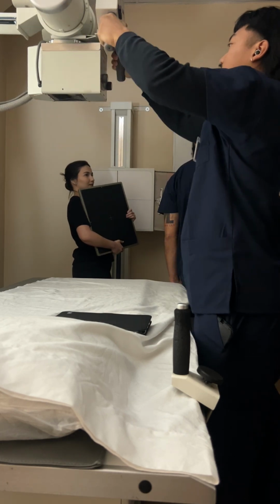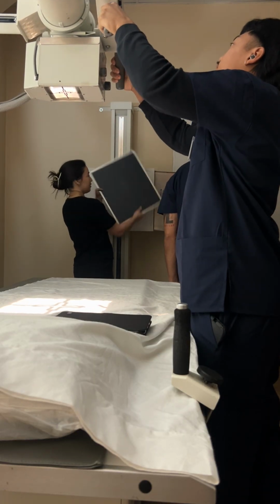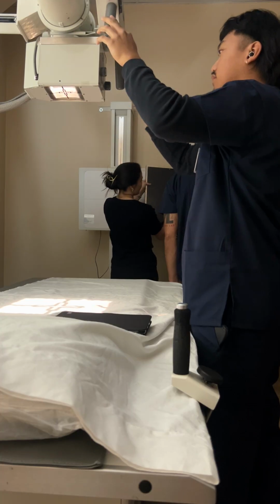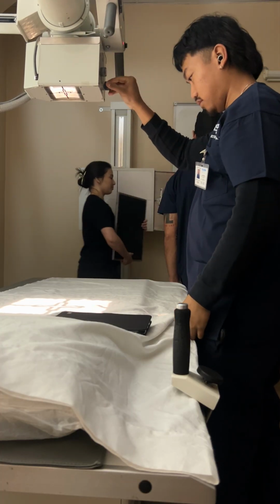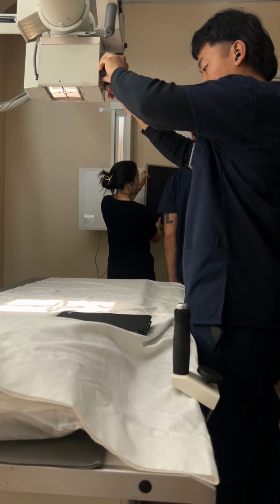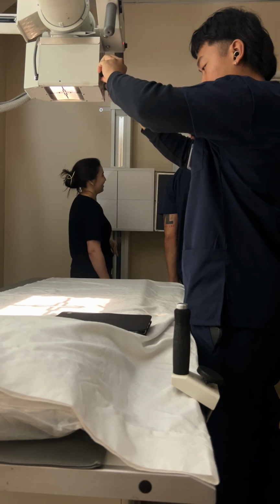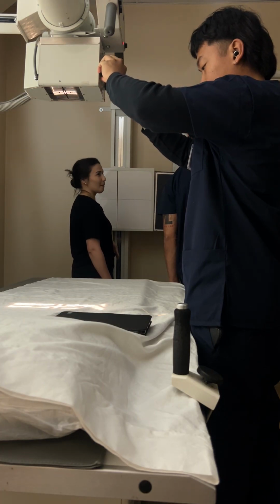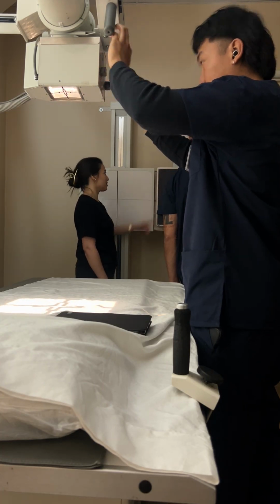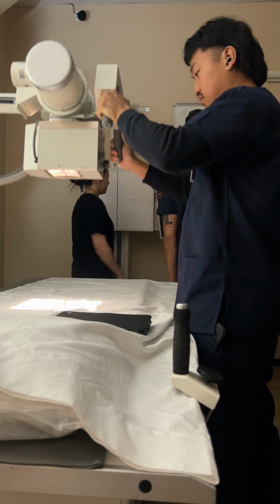Landscape is also crosswise. Portrait is lengthwise. Okay. That is your longitudinal travel.